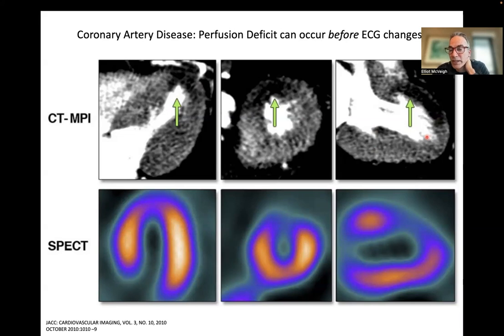And so looking at the spatial resolution of this picture of the lesion, then you look at the same lesion on SPECT and say, okay, well, this is really blurry imaging, right? I mean, we've smoothed it out incredibly, but you can see definitely there's a deficit here. And so that flow deficit gives you a positive signal on the SPECT, and you probably are going to go to the cath lab at that point and see if there's a lesion that should be fixed.